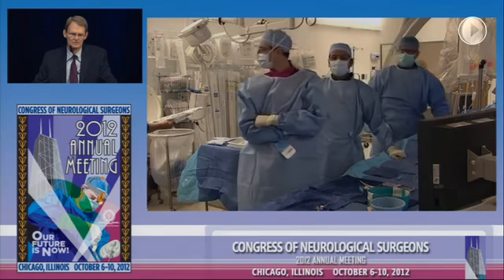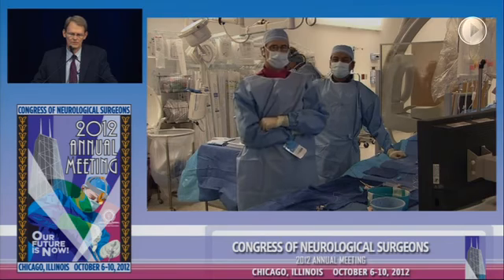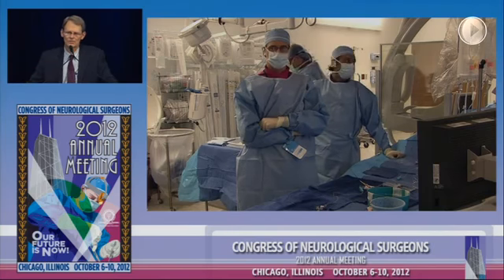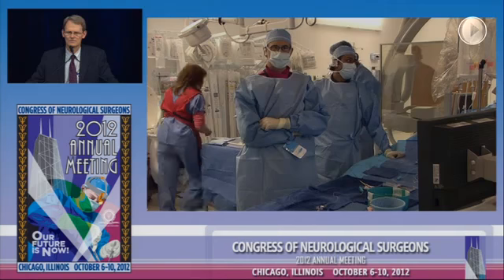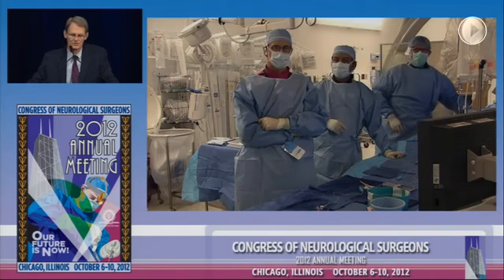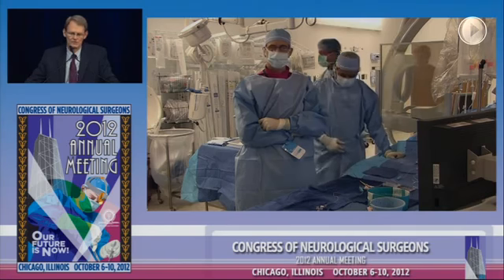I think it's exciting to look back at our own center. If we go back, oh gosh, over 20 years, when A.J. Wakhloo and Baruch Lieber started stenting aneurysms, that led to the collaboration with our aerospace engineering group and the genesis of the Toshiba Stroke Research Center, where lots of interesting things have happened over the past 20, 25 years. It's just been a wonderful opportunity for us to combine translational research with the clinical procedure, which is really what this is all about, isn't it?